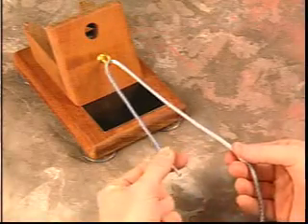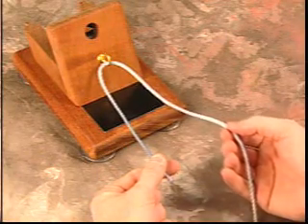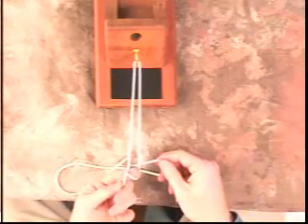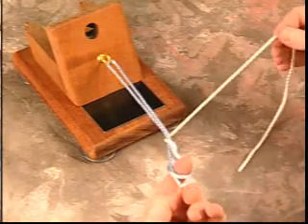This is a demonstration of the Buntline hitch. Initially, the post limb is one half the length of the loop limb. You then secure the sutures with your index finger between them, and do a throw over the top around both sutures.